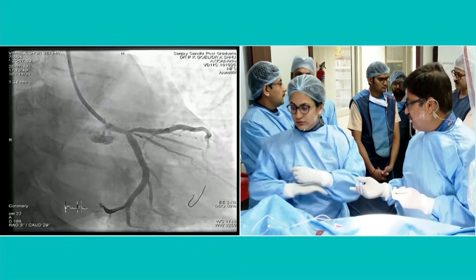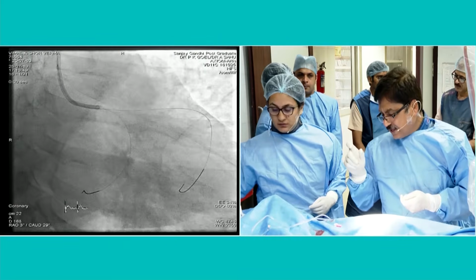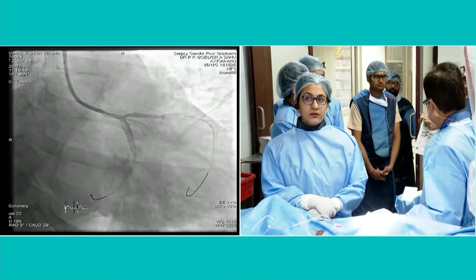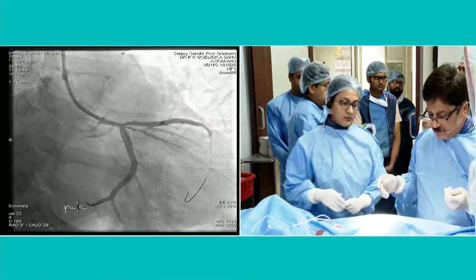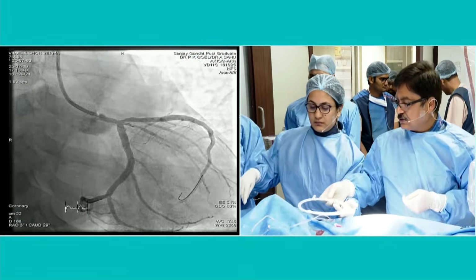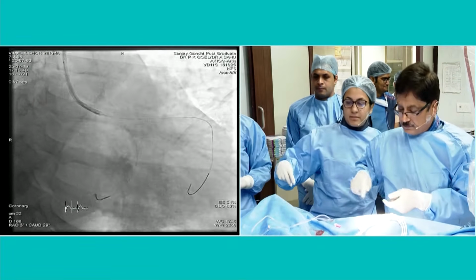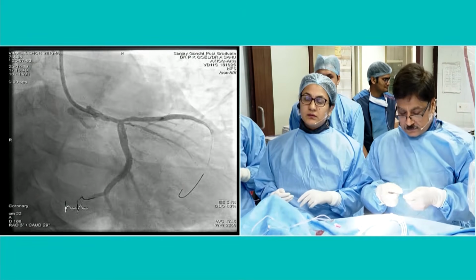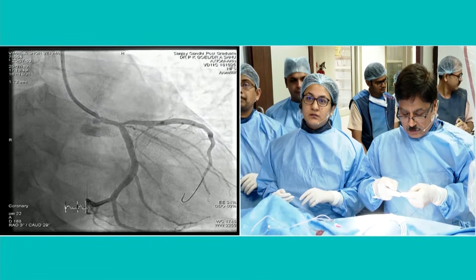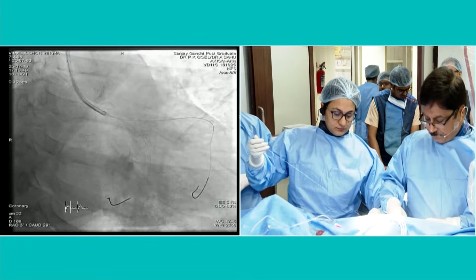I thought I will put the stent and then expand the side holes and then do the IVUS in both directions. That's what I was thinking. Particularly in this case, testing the circumflex with the IVUS will probably not add much on top of what you already see, because what you ultimately need to know is the size, and definitely the size of the body of left main particularly, and then maybe afterwards you can check. But looking at the anatomy, although there must be some involvement of the left circumflex ostium, it's not a big issue.